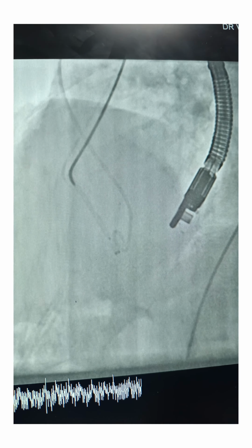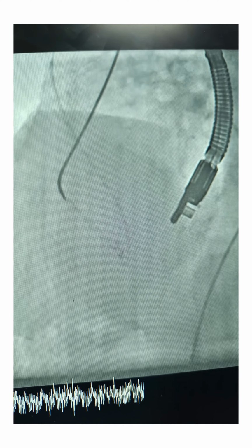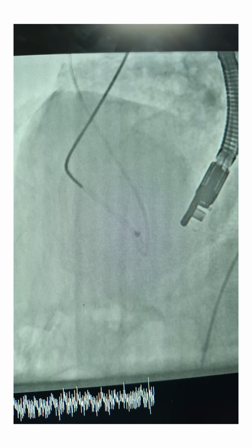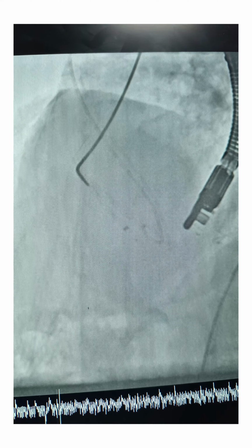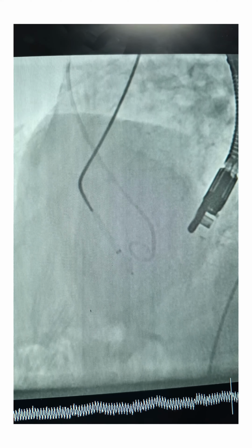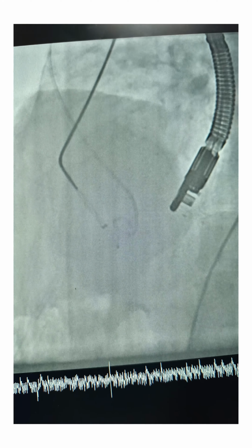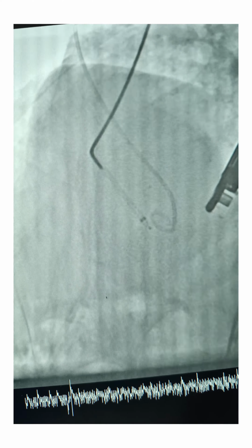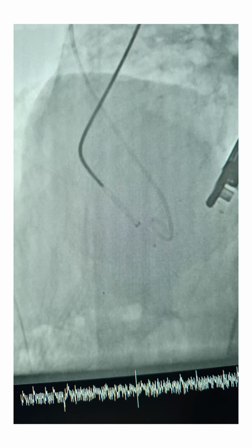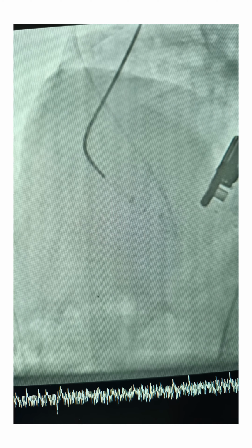So here I had taken the device. It's a Life Tech muscular device, 8 mm. So I have started my deployment. First disc. I had to stand at the head end. It is quite challenging to do. So I am doing this from the head end. I am trying to deploy the first disc. I am using peeling and pushing techniques together. Now the first disc is deployed.